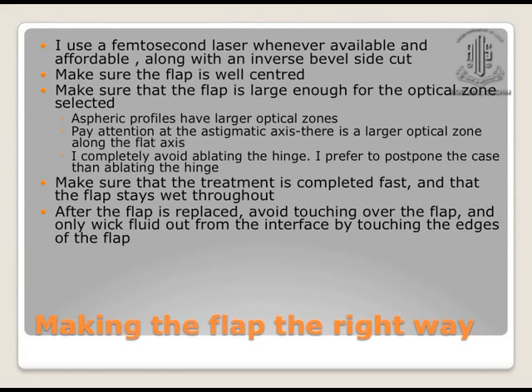And after the flap is replaced, I avoid touching over the flap because that would disturb the epithelium. It's enough to just put a wick on the sides and extract out excess fluid and do some form of ironing, maybe with the angle of the cannula, or I like to put a drop of viscoelastic in the center, which keeps the cornea even lubricated in the initial post-op period.